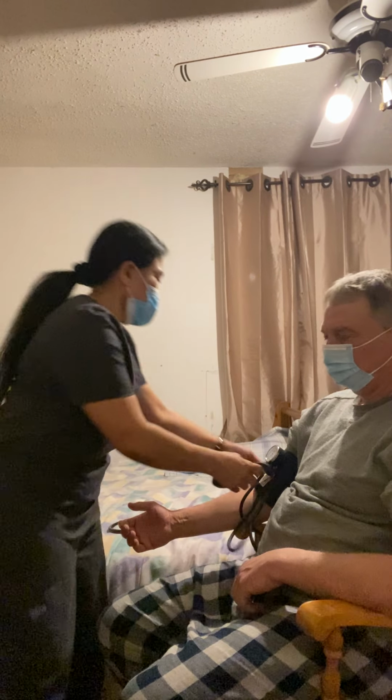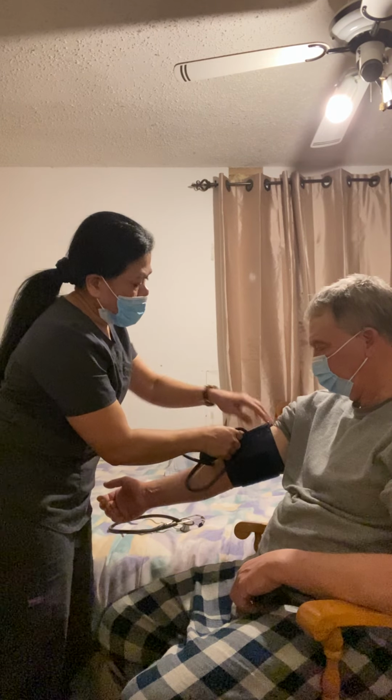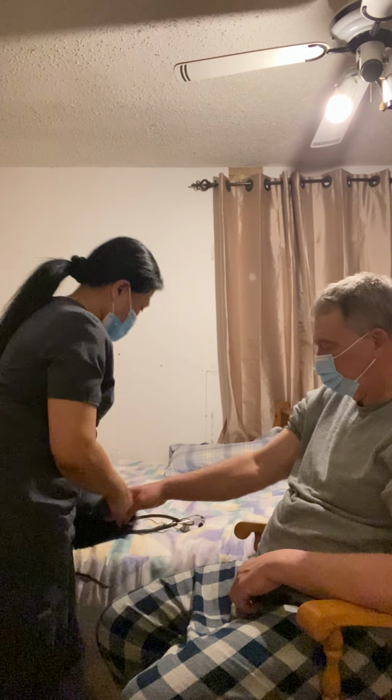So let's wrap up our vital sign demonstration. We will take off our devices, and then we will clean them.